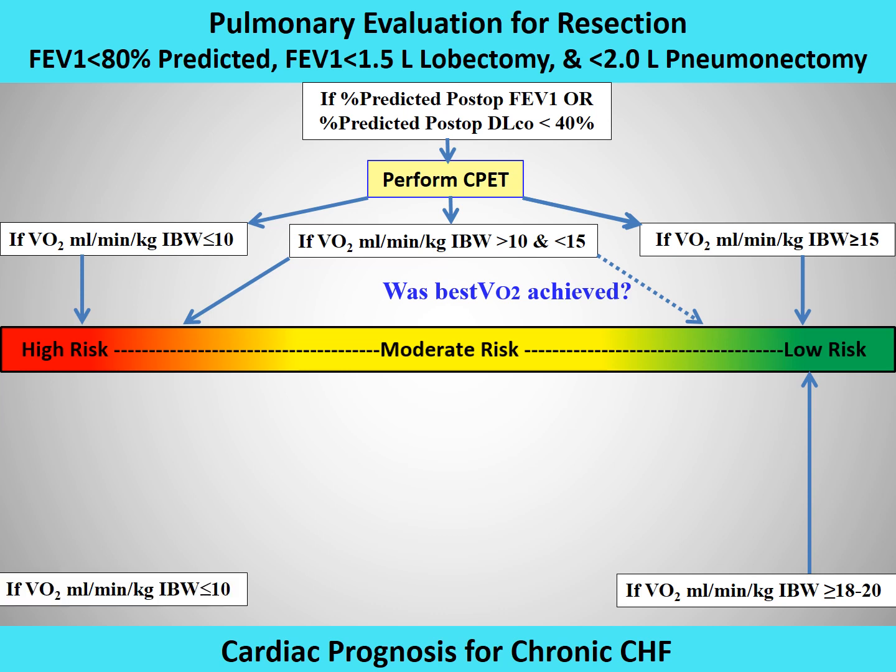At the other end of the spectrum, a VO2 per kilogram of 10 or less again conveys a pretty grim prognosis. However, they recognize that a patient performing a suboptimal test or poor effort can give a reduced value as well as bad disease. They use the RQ, or respiratory quotient, which is looking at the VCO2 divided by the VO2 to help sort this out.